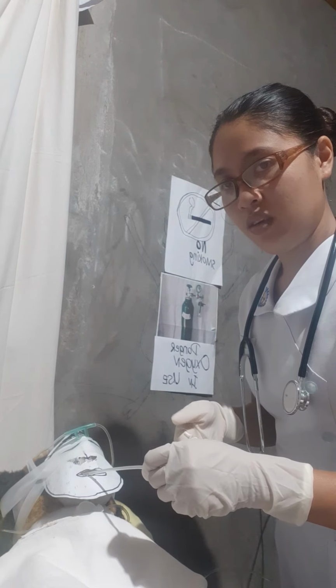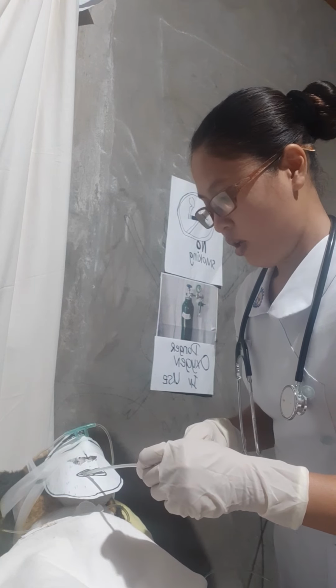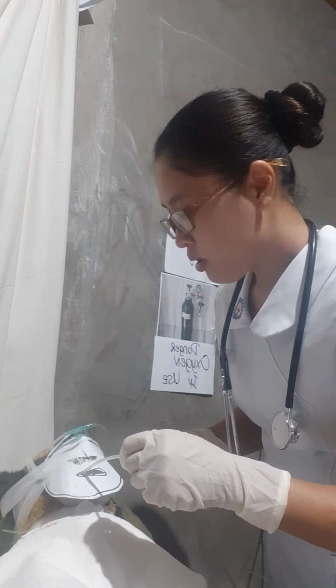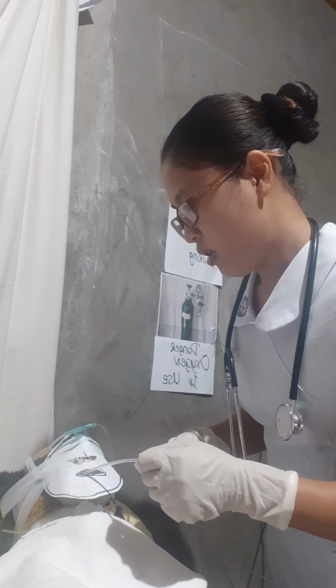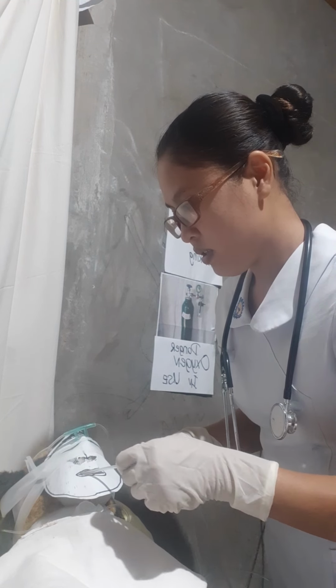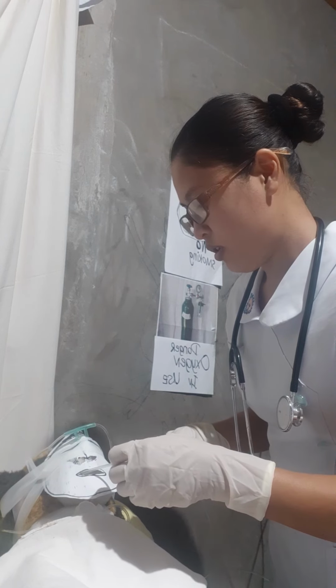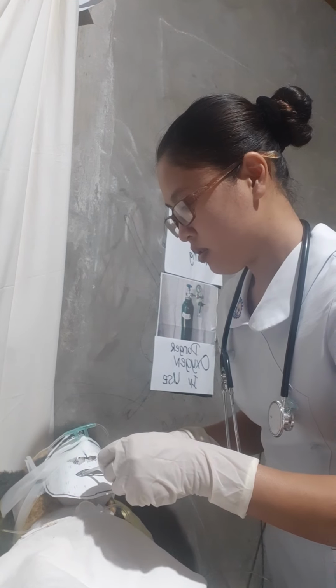Do not put the finger into the port because it will suction. And if there is anything, we need to advance it into the trachea. Next, advance the catheter 3 to 4 inches to reach the pharynx.